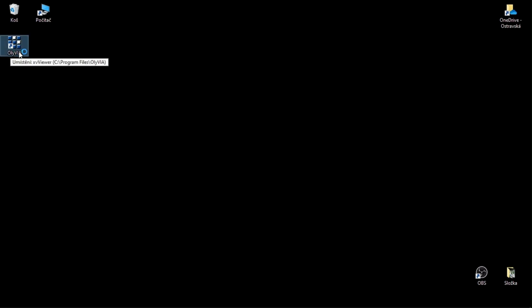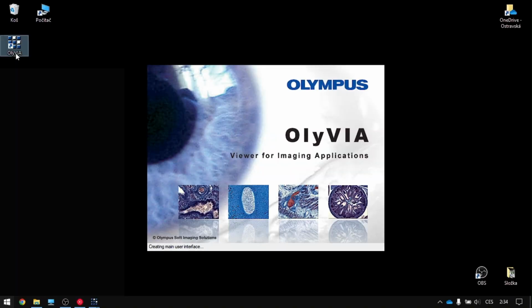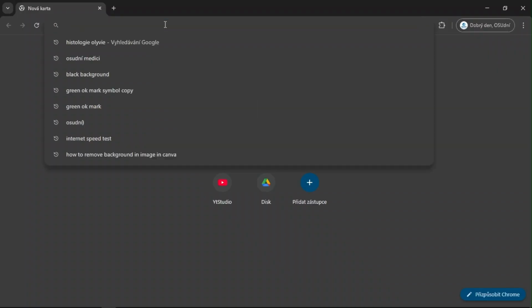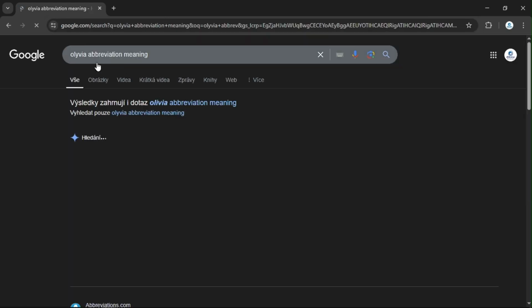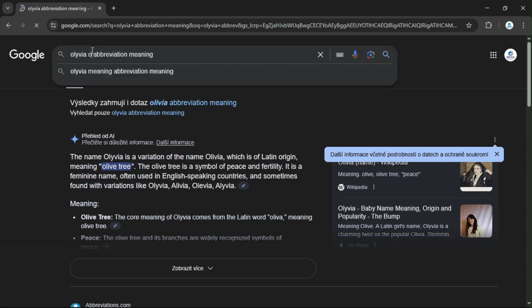It's an abbreviation of, I don't know, we can try to find out. I'm just wondering. It's from the company Olympus, as you all might have already known, the digital technology company. We can try searching.